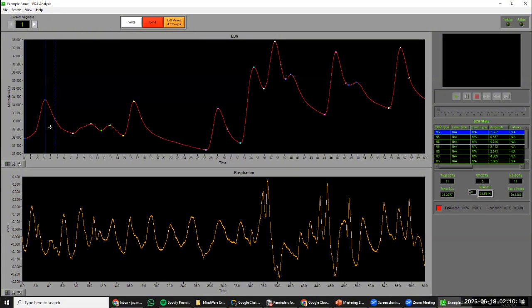But it is still possible, even using the correct sensors, that we see this kind of change. And this is in a lot of cases just due to someone that maybe could have something like hyperhidrosis, right? Just extremely profusely sweating.